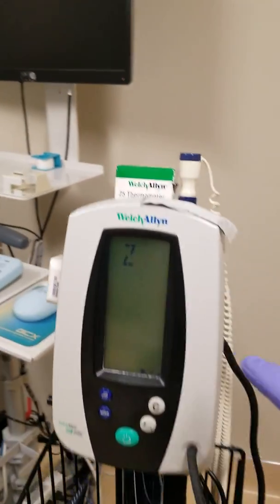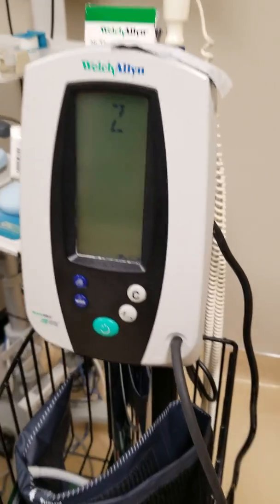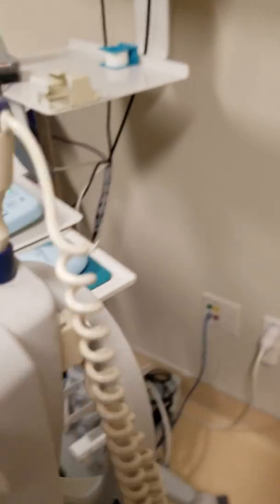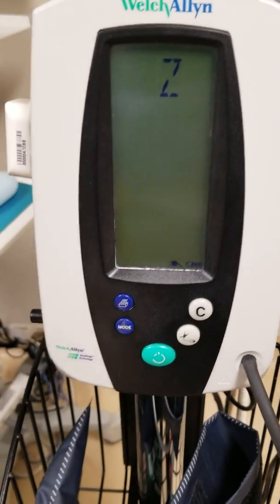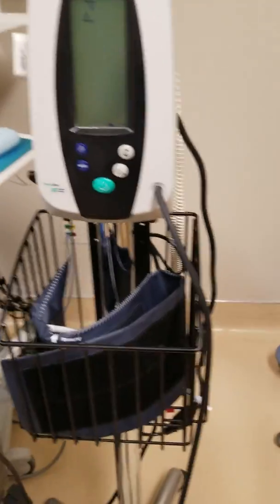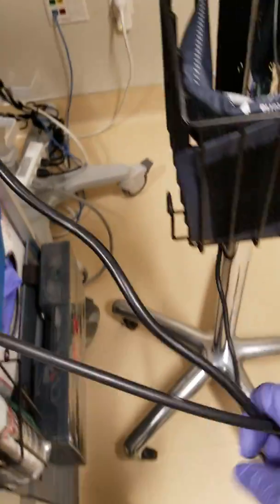Today we're going to be checking a Welch Allyn blood pressure pump — this is a 42 NTP, I believe, and the model is Spot Vital.